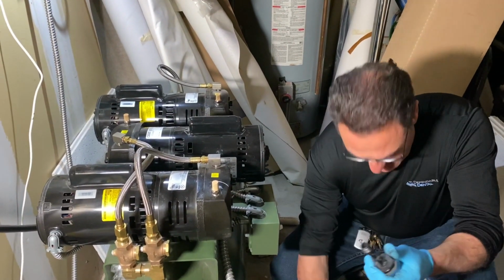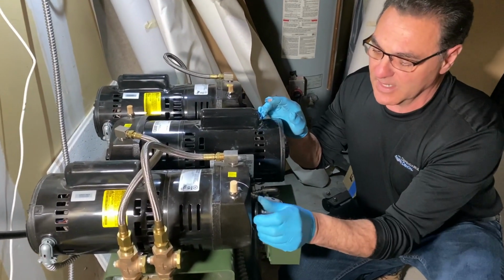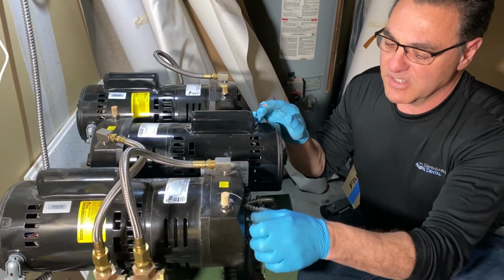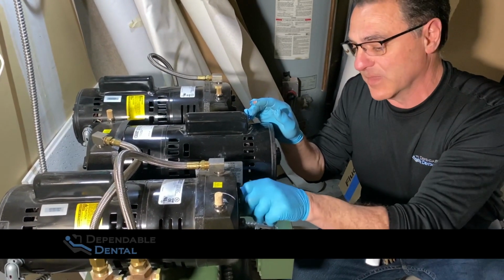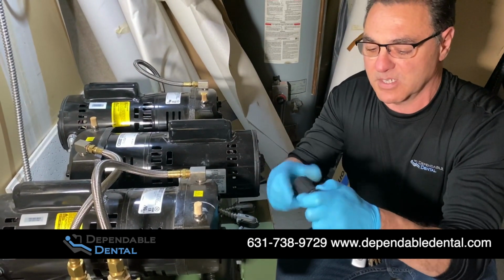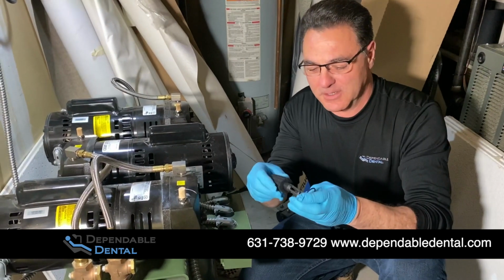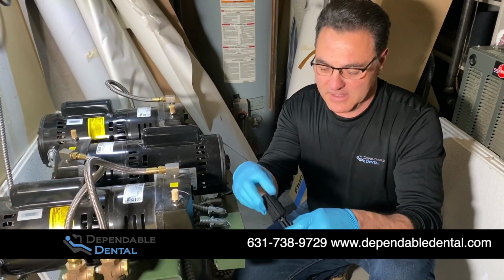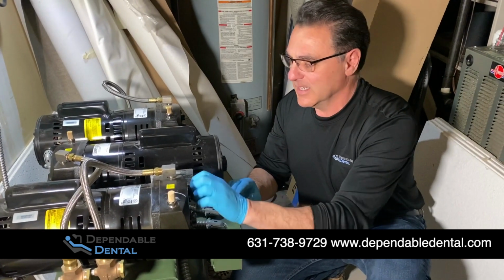So I'm going to take the new filter, slide it over the spindle, and just pop that in there. Again, make sure you have the spindle handle, because sometimes just by virtue of taking them out, you will break them. So you want to have that in your truck or in your case of spare parts. Taking the filter off. Alright, so putting the new filter onto the spindle. Make sure the O-ring is seated properly. Slide that on, pop that in, and twist it nice and tight.